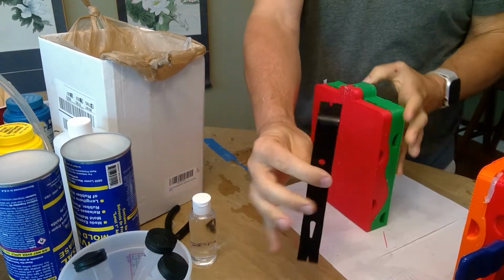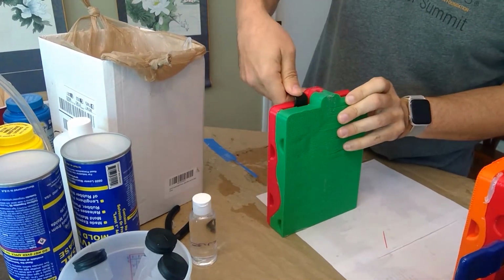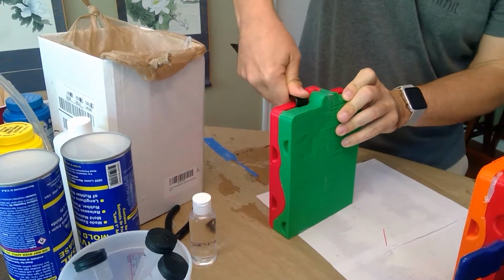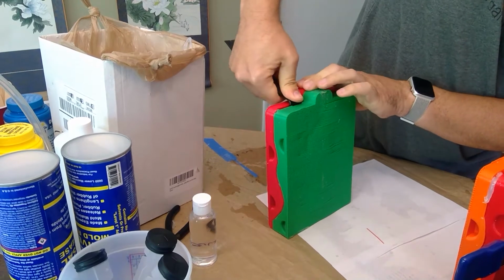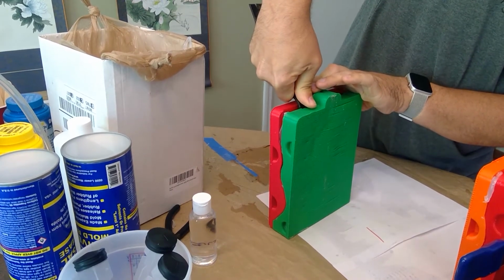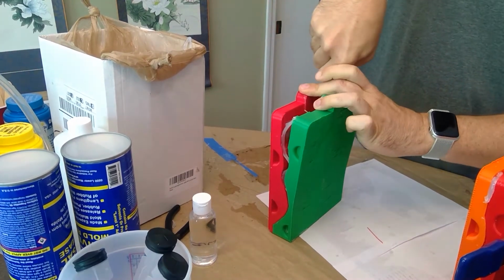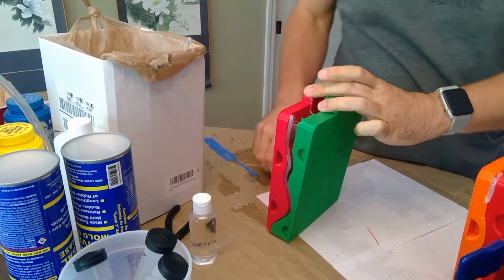You take your pry bar and you insert it into this little gap as far down as you can press. Push down hard and pry it out until you hear a pop. There you go. Then you go to the other side, get its pop.